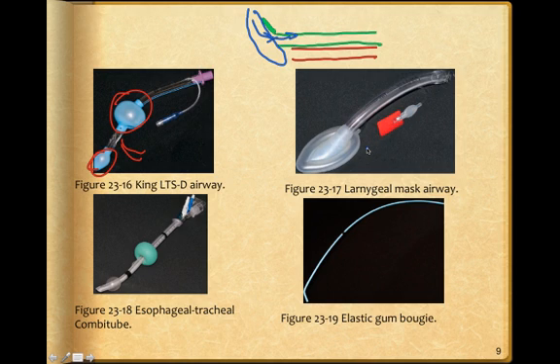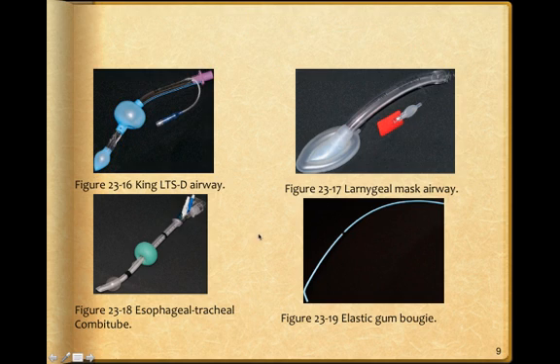Now, this works pretty good if you can verify that your patient has not had any kind of food within the last 12 hours. They use these in surgery quite a bit. The problem with it is there could be pressurized Taco Bell in the gut, which could easily ramp up and cause aspiration with an LMA device. Last but not least here is the Combi Tube.